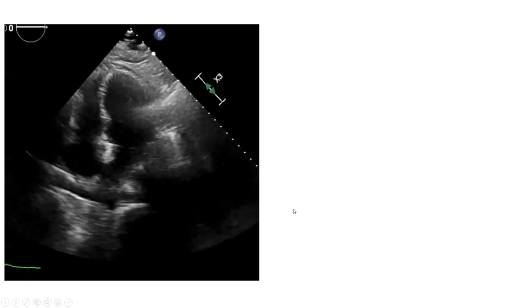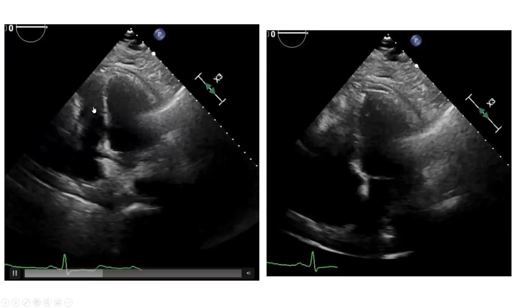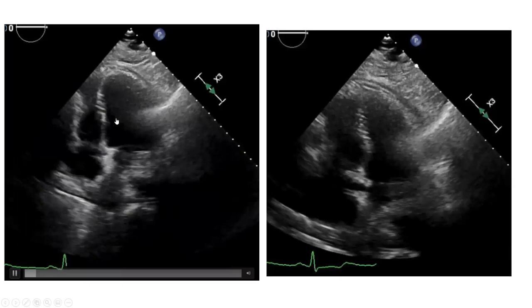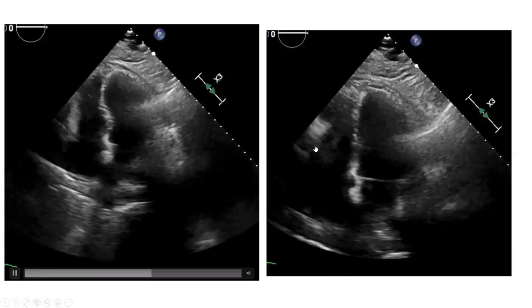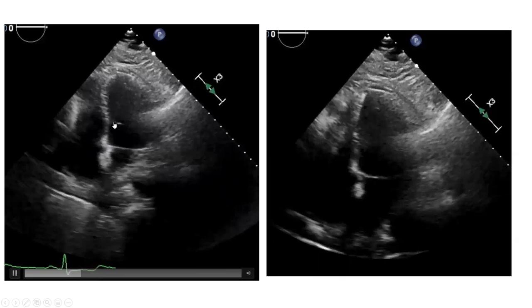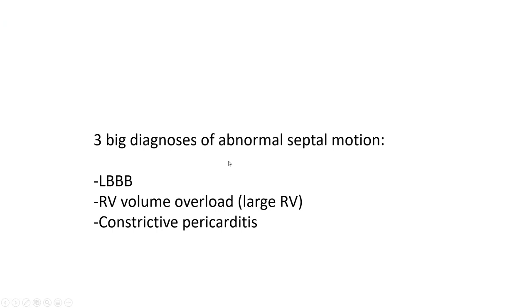Here is his echo from the outside hospital. The striking abnormality is the septum — you can see it is moving abnormally. Even if you're not an expert in abnormal septal motion, it is clearly abnormal here. There are three big diagnoses of abnormal septal motion: left bundle branch block, right ventricular volume overload, and constrictive pericarditis.